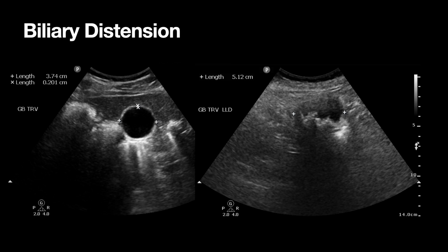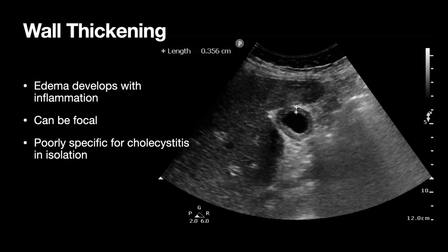And we want to do transverse diameter. It's the most accurate way that we can do it, as opposed to an AP, given some of the artifact that you might see. Just a nice transverse diameter is going to give you that best accounting for it, right?